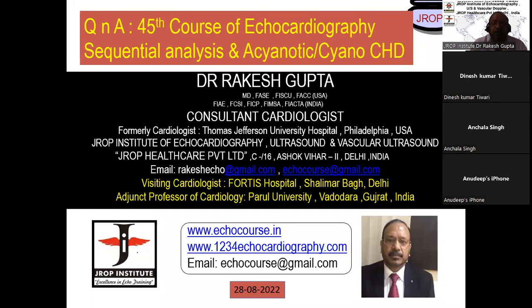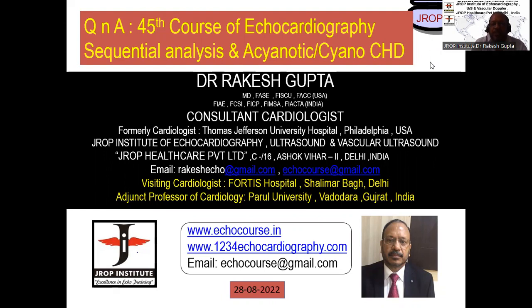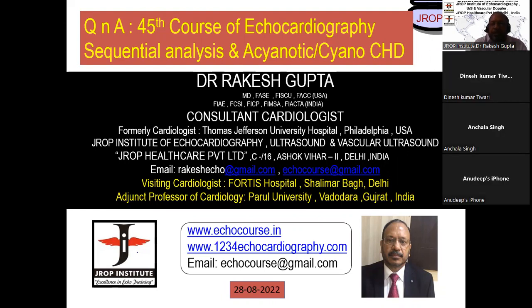I think this is going to be the last session for this 45th comprehensive course on echocardiography. We're going to have interactive question and answer sessions from all the delegates. I'm going to show you some slides and expect each and every one of you to identify them, because that's important for whatever we have learned. And most important, even if we have not learned anything, we are going to learn more.